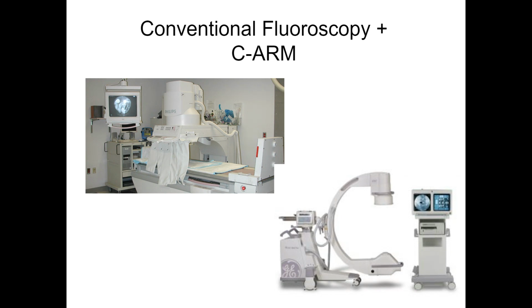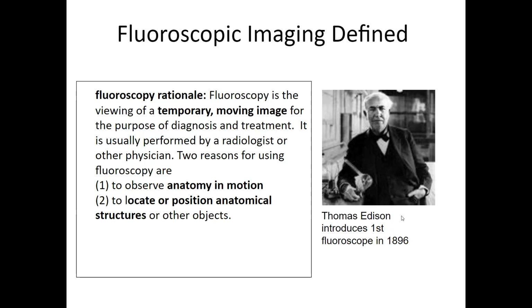But what makes this, in my mind, conventional is that we're still using this big, clunky image intensifier tube that we're going to go over in lots of detail and kind of reveal that mask and see what electronics are hiding behind there. Lots of good stuff in there. Very similar in many ways to an X-ray tube. So you'll see some of the same language. Like, for instance, there's an anode and there's a cathode, and there are electrons that fly around, and there's heavy-duty kV that gets applied to the image intensifier tube, but we'll get to all that.